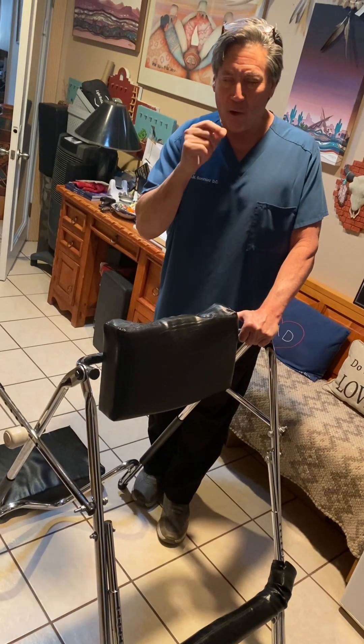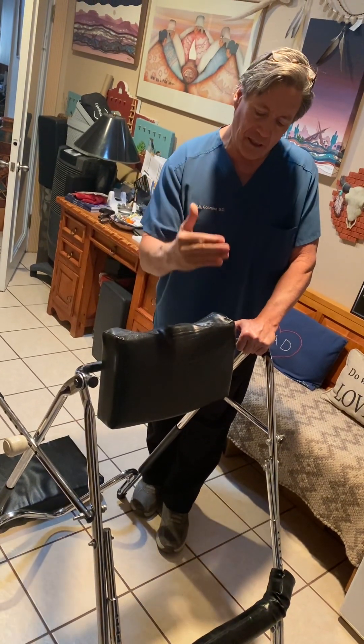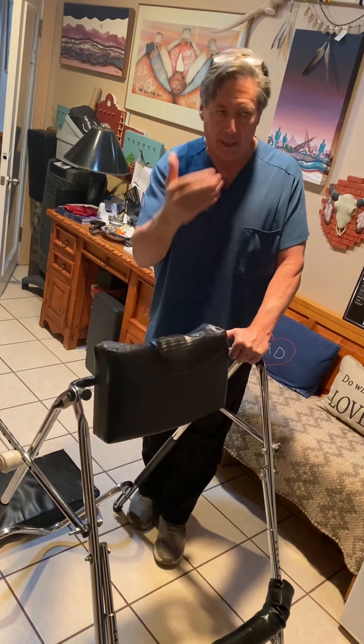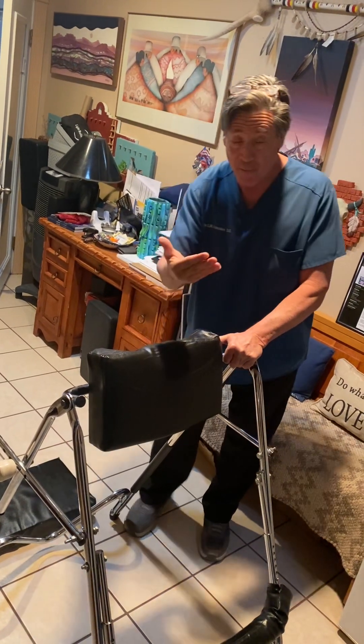Hey everybody, we are going to do a quick demo on using the spinal line body decompression, spinal decompression machine. Eric's going to help us and demonstrate for us.